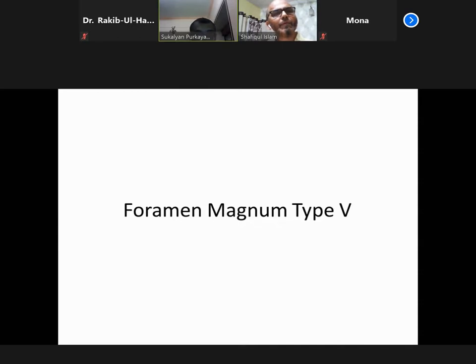But now Scepter Mini is coming, which is something like a microcatheter through which you coil. So probably with Scepter Mini you can take it. But in case of an occipital artery or a superficial temporal artery, you can take Scepter Mini or Scepter and embolize that, which is definitely a good option. But I will tell you how I deal with my cases. I don't like to use a balloon, but how do I do it? What we do is just the pressure cooker technique, which is something like a balloon.